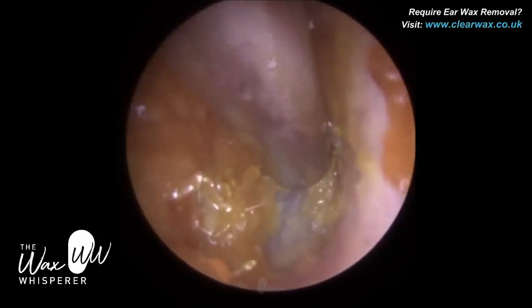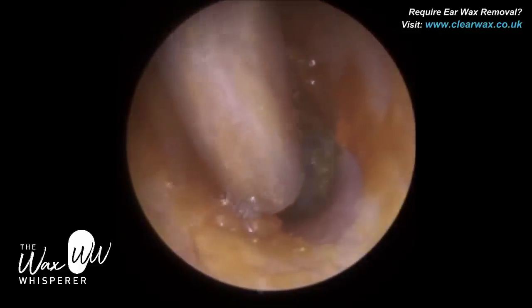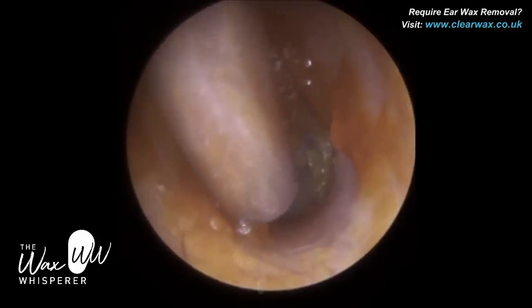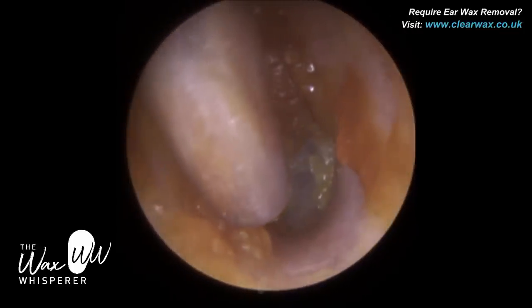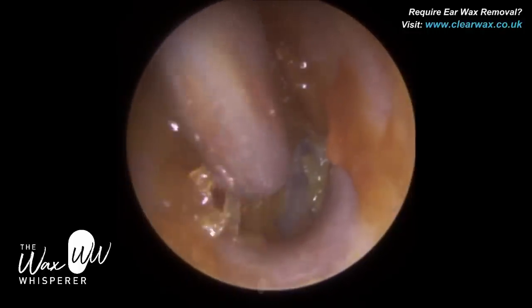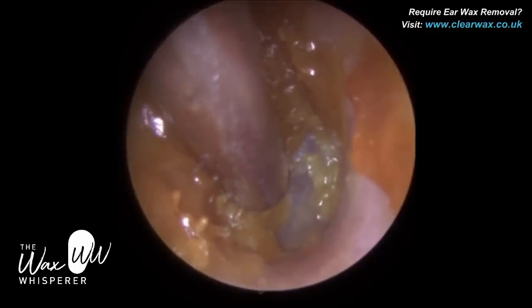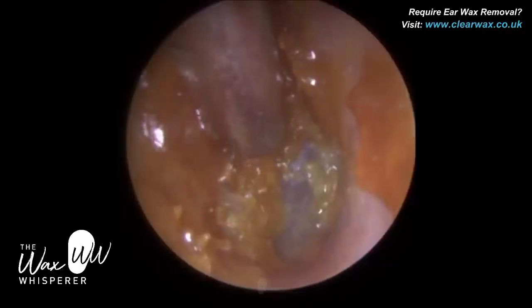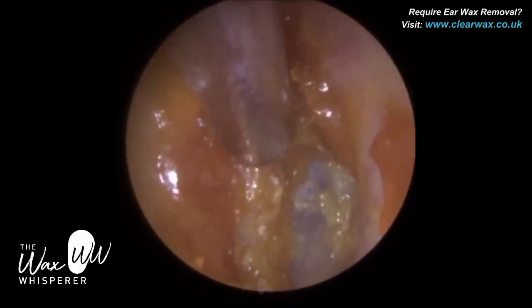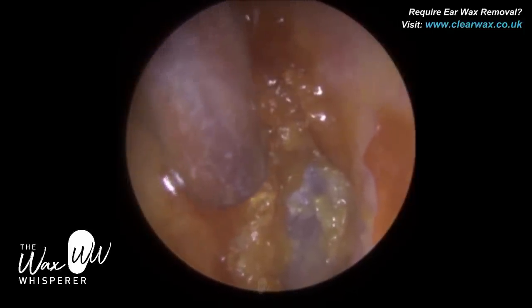However, sometimes people find that uncomfortable because you've got this object inserted into the ear canal. With an endoscope, we actually use the endoscope itself to do the job of a speculum and stretch and widen the ear canal. And one of the reasons why an endoscopic approach — not only in earwax removal but endoscopic ear surgery — is now so mainstream and exponential in use, is the field of view it provides. It's just incomparable.